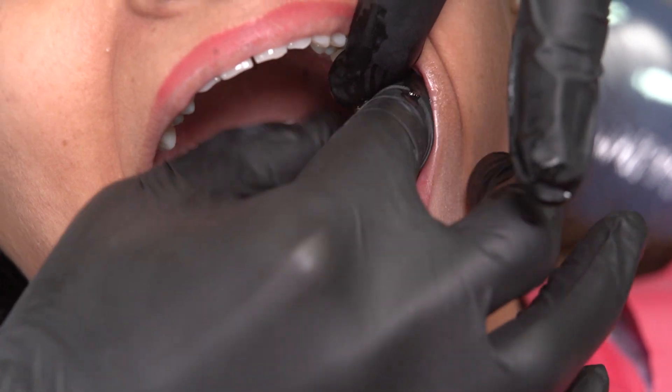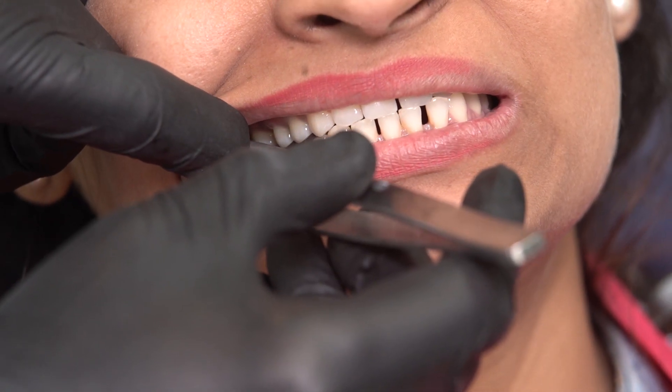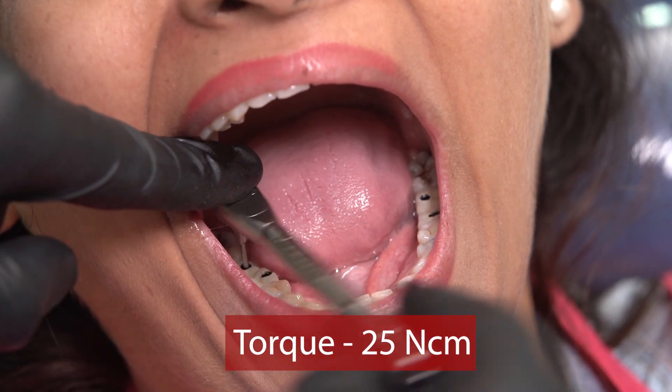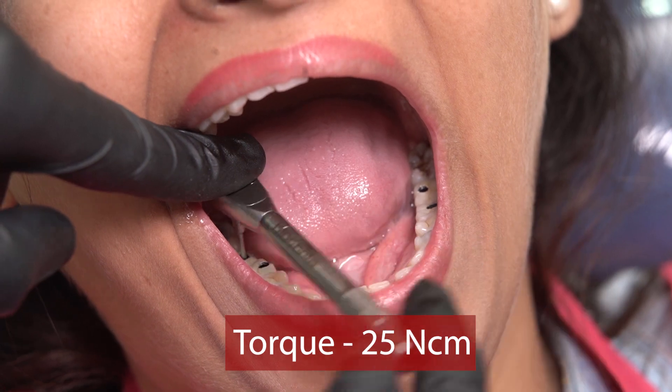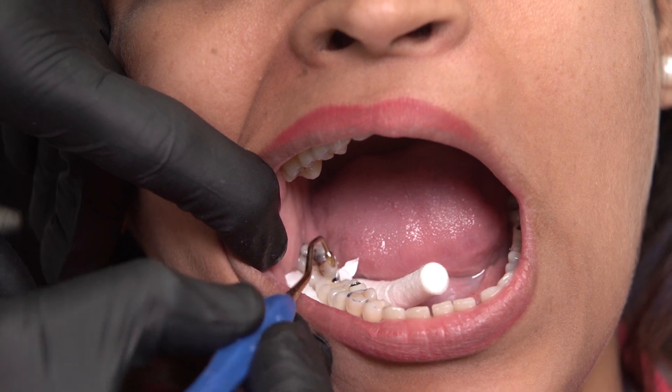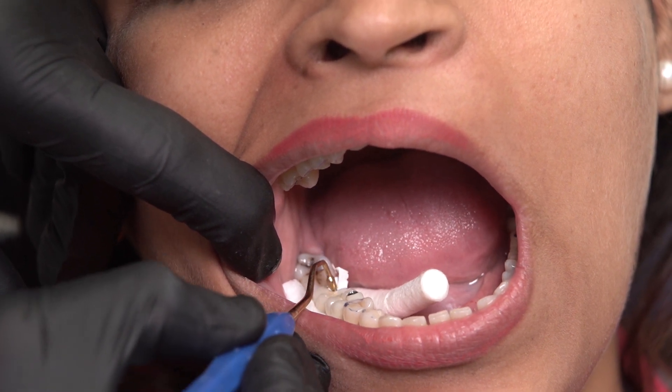And that's the other side. After verifying occlusion, I can go ahead and torque these bridges into place using the Biodenta torque wrench. I just need to now block the access hole, and for this I will place some teflon inside the channel so that my composite doesn't clog the screw heads.